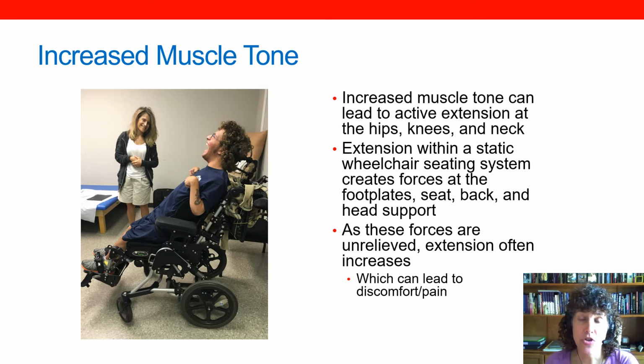As these forces in a static seating system are unrelieved, extension often increases in response to that unyielding surface. That can lead to discomfort and pain.